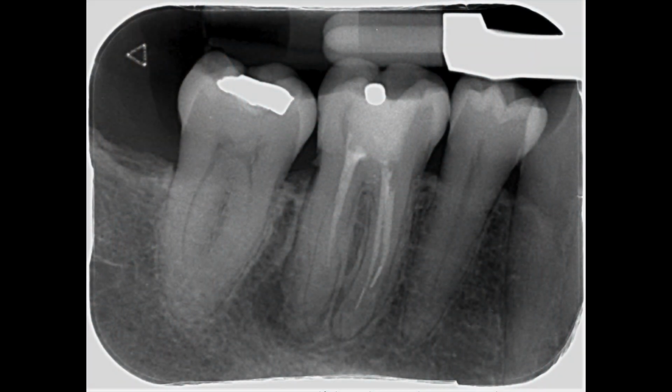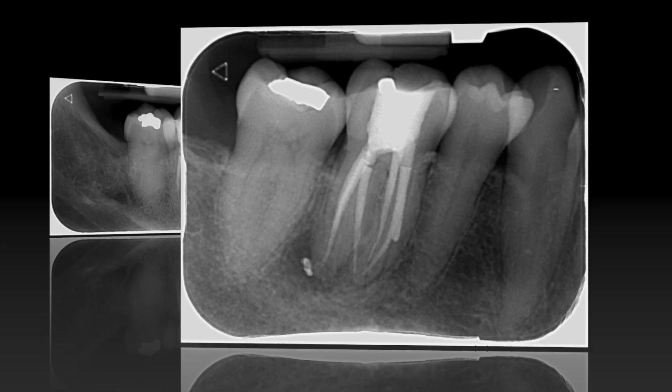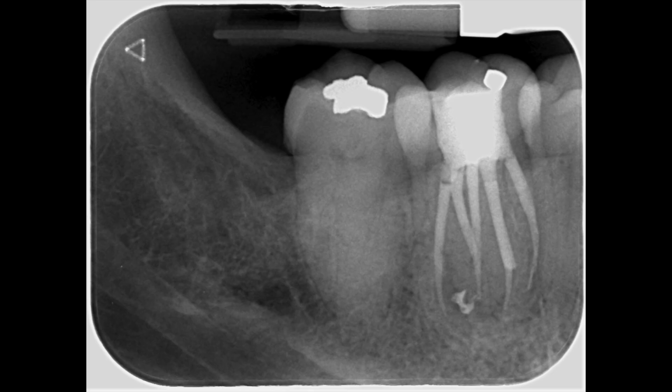Here is the preoperative view of the mandibular right first molar, showing the poorly obturated root canals and periapical abscess on the distal root. This is my first post-op radiograph, and it shows good coronal apical seal. You can see that little ledge that I was talking about in the mesiolingual canal. This is really unavoidable when trying to retrieve instruments so deep from within the root canal system. A distal angle view shows the distal canals very nicely in convergence of 2 of them. The mesial canals are both obturated to the full working length.